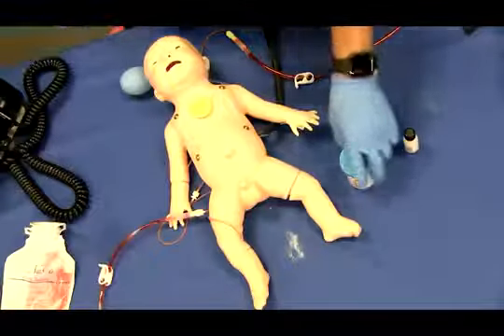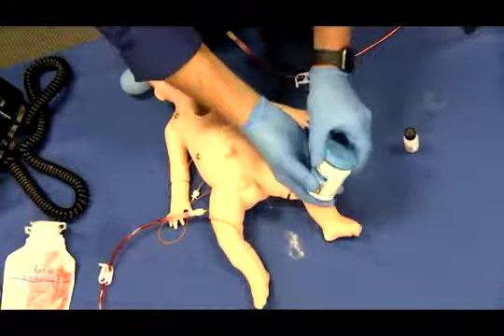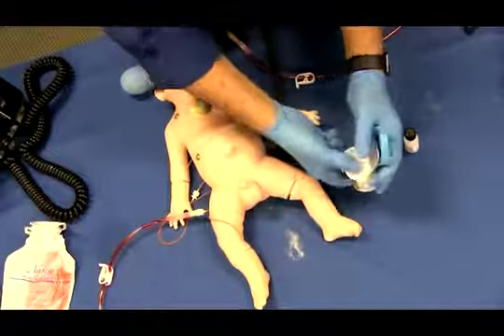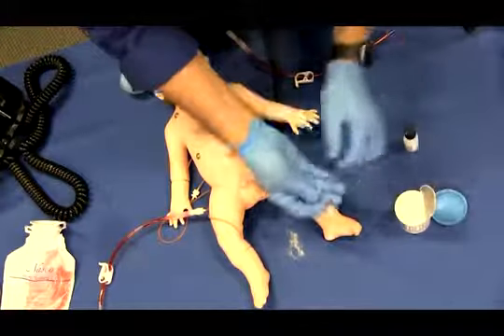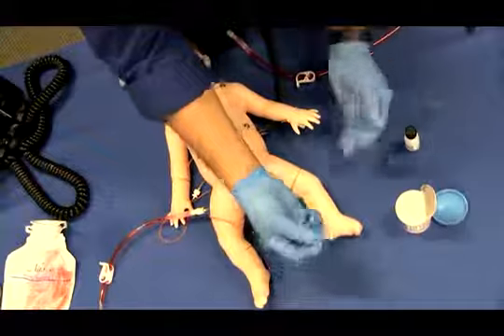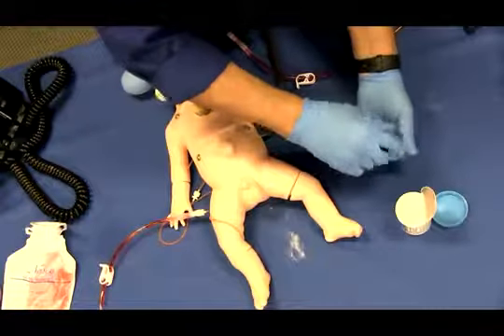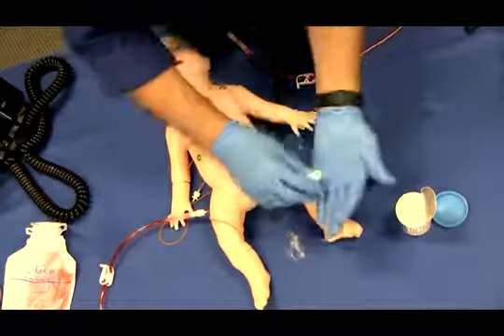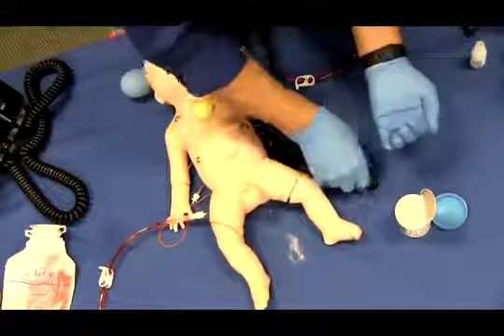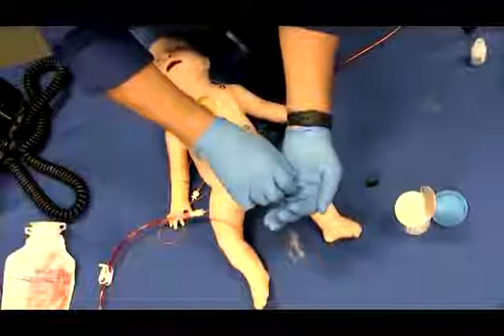Administering rectal medications and performing a temperature check. The anal opening of C.H.A.R.L.I.E may be used for the administration of rectal medications in suppository form or performing a simulated rectal temperature. It is recommended to avoid infusing fluids. Always lubricate anything that will be inserted into the rectum with the supplied lubricant.